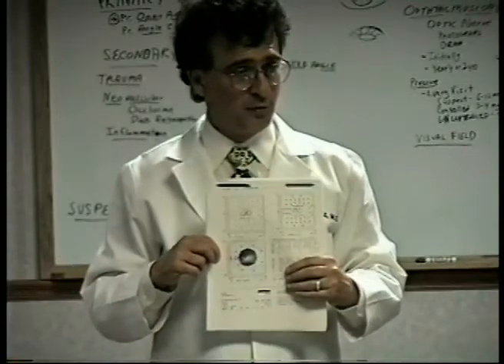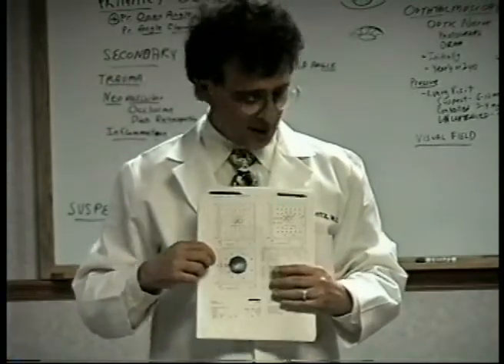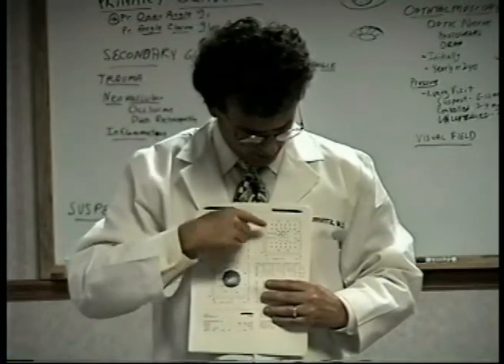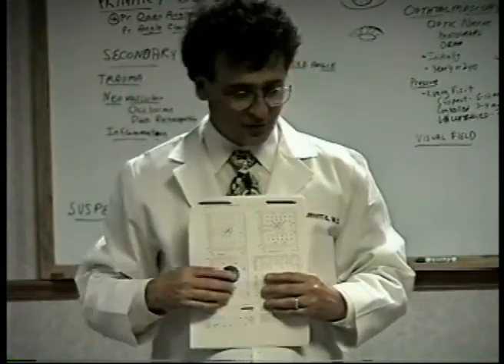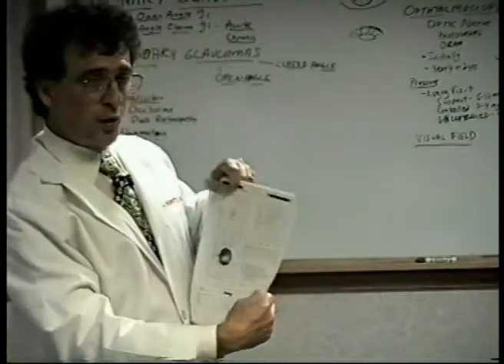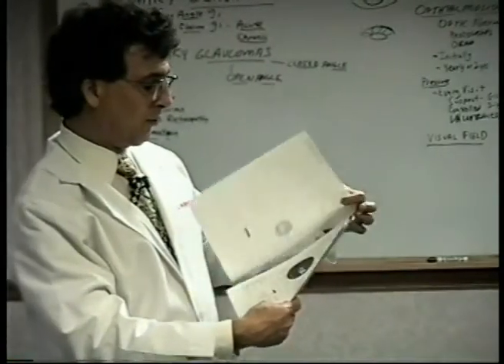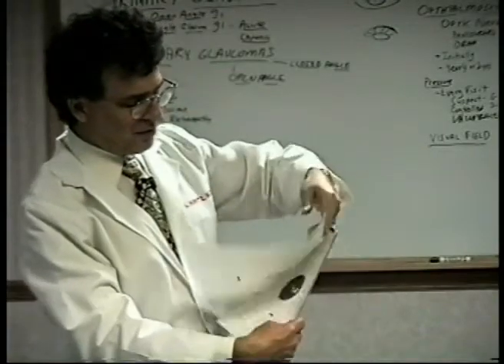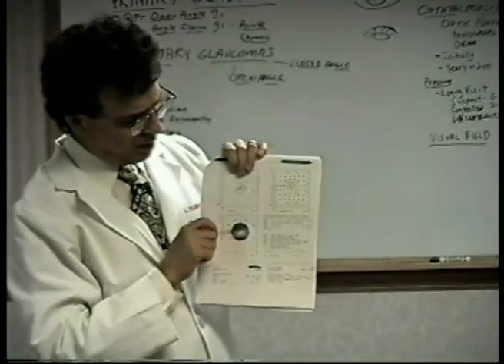Now, if you look at your field now, that would scare you a little bit, right? Look at all the dark spots, infinitely abnormal around here. And there's a couple little pluses right there near the center, which says some of it's still normal compared to his age-corrected normals.